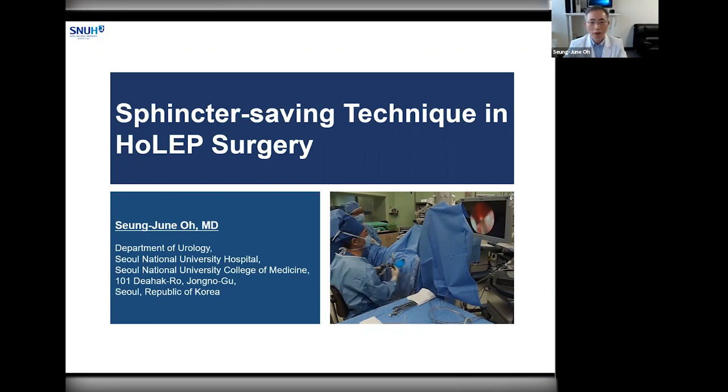These core concepts of HoLEP surgical technique can be applied in the same way to other enucleation techniques using different energy sources such as thulium, bipolar, and so on. Collectively, HoLEP technique is currently expanded as a part of anatomical endoscopic enucleation of prostate, or AEEP.